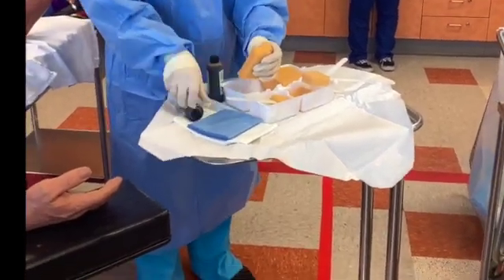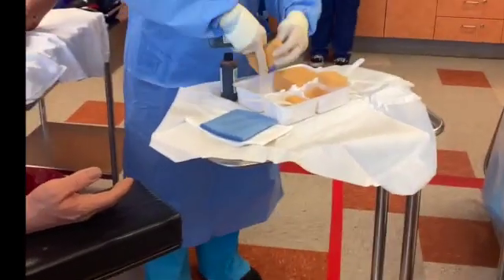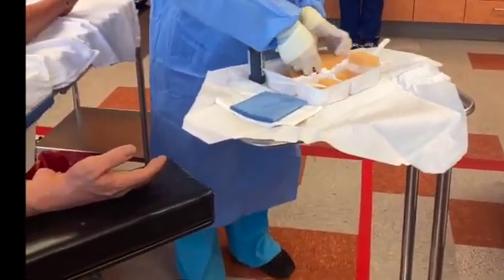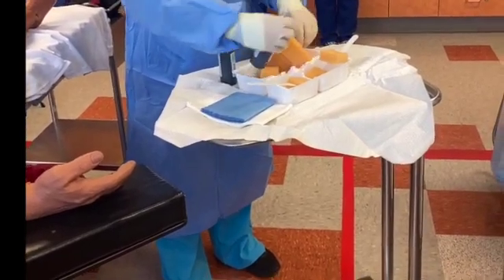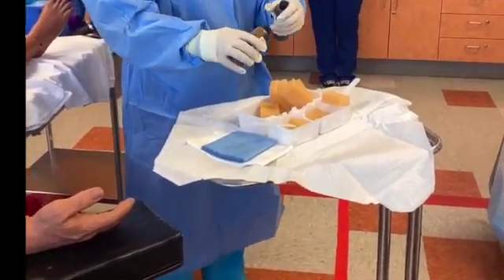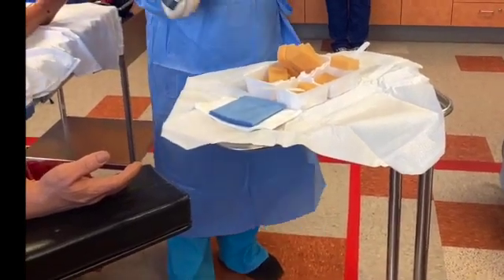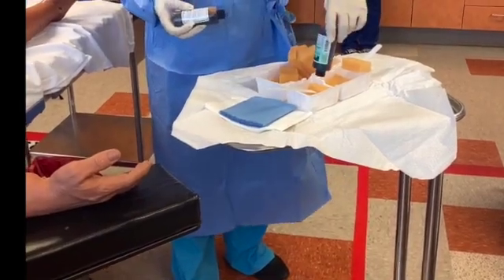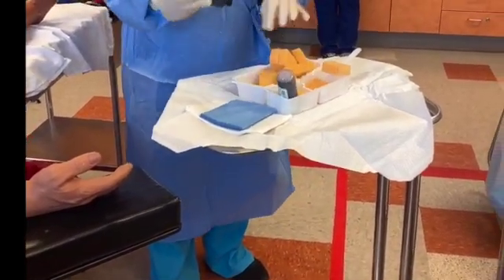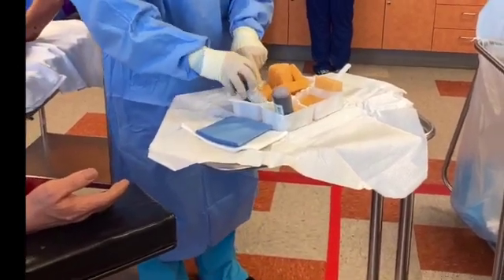You guys gotta make sure you know how to open glove. So by the time I'm gloved, like, thank you, girl. You're welcome. Cool. Do you really want me to pour? How many do we have? 4. No, we have. Okay, so the green goes with the lollipops, and the scrub goes with the sponges.